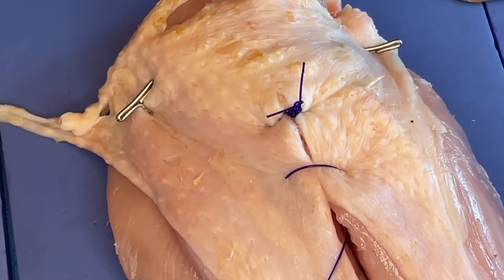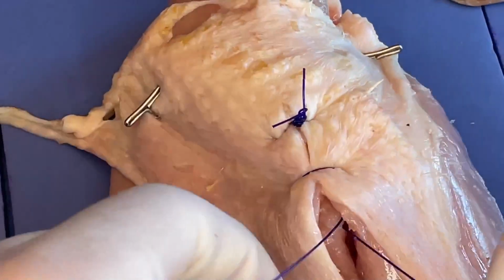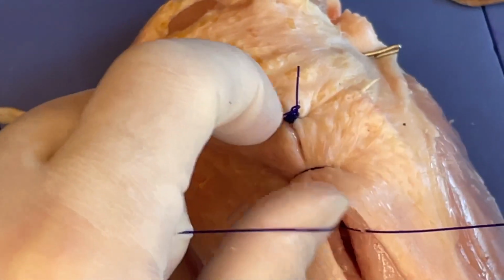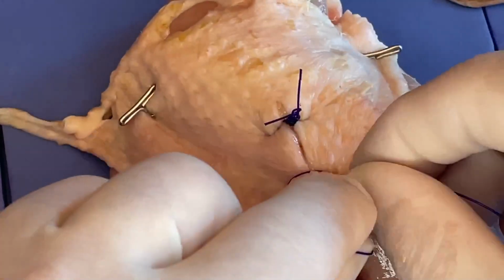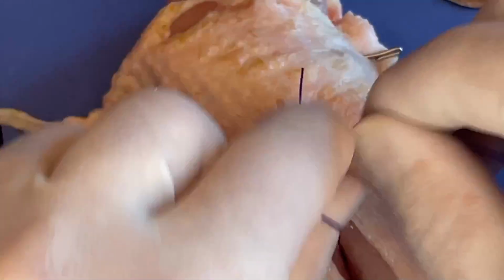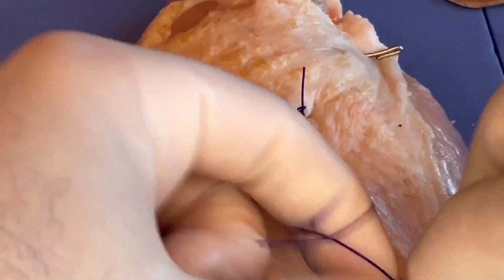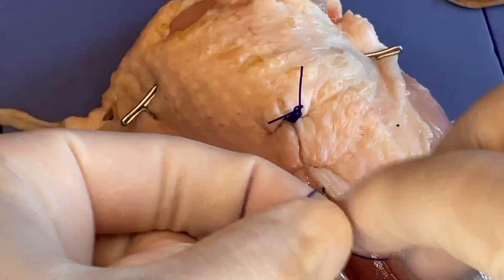Pull this through. So finger first here, just because of how it's lining up, and then tighten that down. We did fingers, so there's thumbs. This is our first square knot. Throw number 3, number 4, 5, 6, 7, and 8.